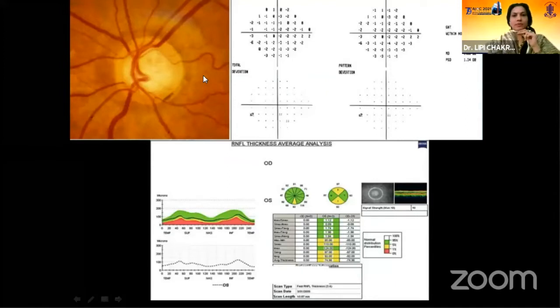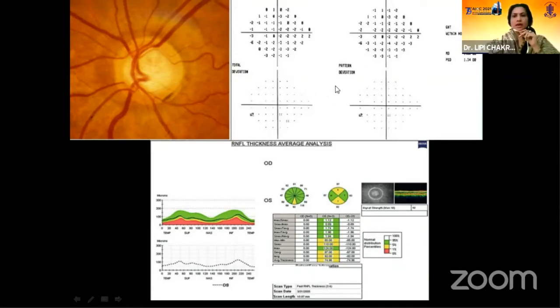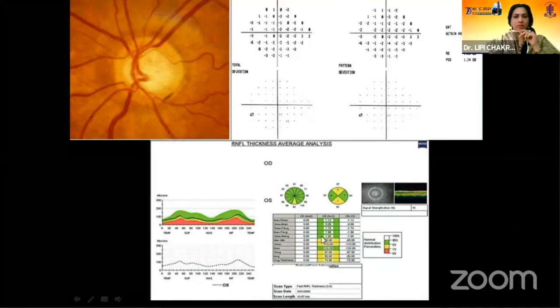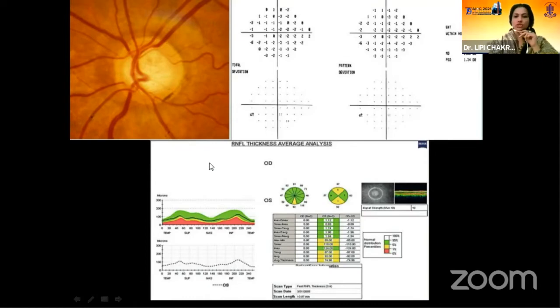This is pre-perimetric glaucoma where OCT is again useful. This might be labeled as a big or physiological cup, but we are finding here some hemorrhage, possibly due to systemic factors. SAP is normal. When we see the OCT, we are finding some yellow, and the RNFL graph curve is not really in the green — it's going towards yellow. So we need to be cautious. This is the use of OCT in pre-perimetric glaucoma.